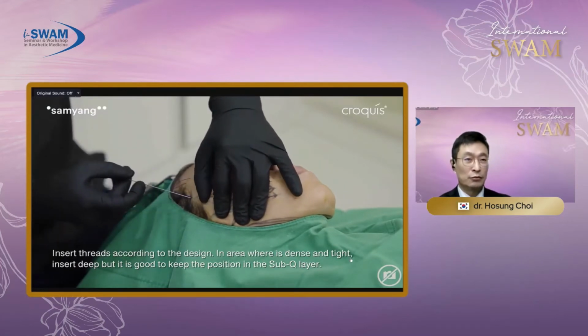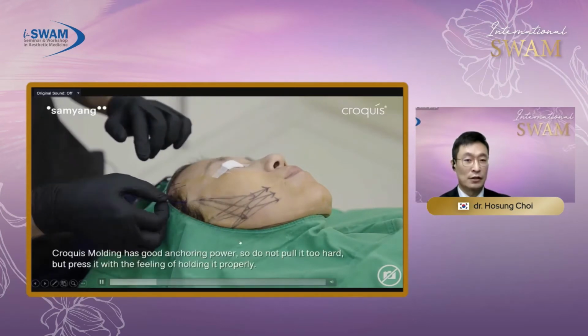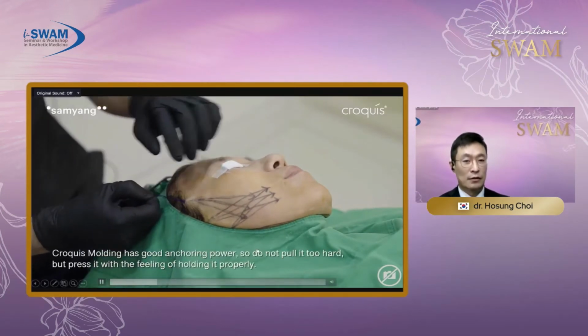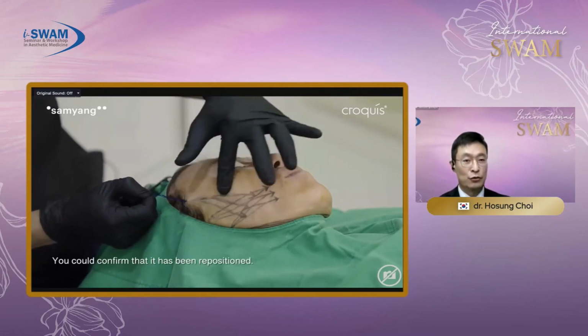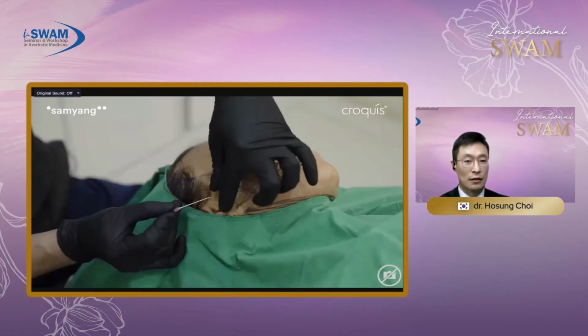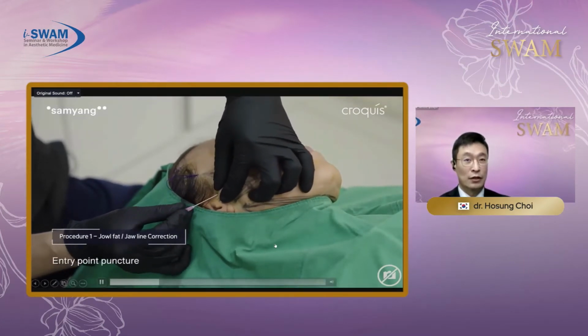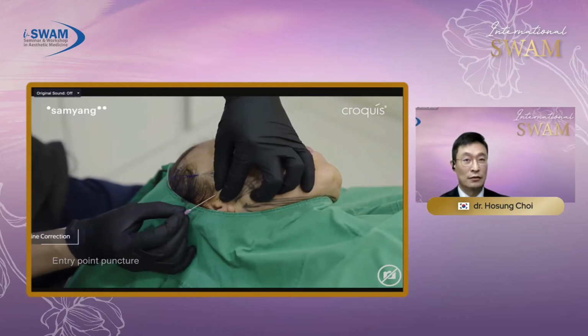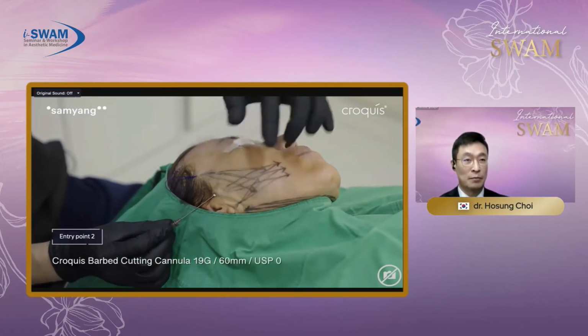Usually there may be some resistance in that area, which is the subzygomatic arch, due to very tight zygomatic cutaneous ligaments. So pinching the skin is quite a useful method to maintain the constant depth.